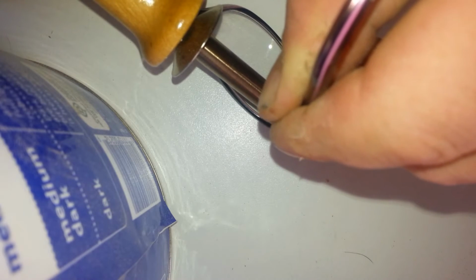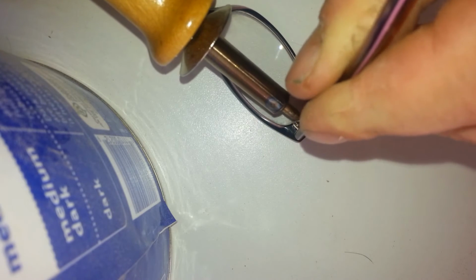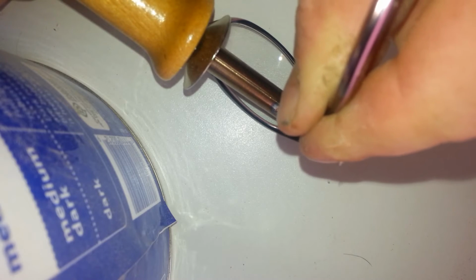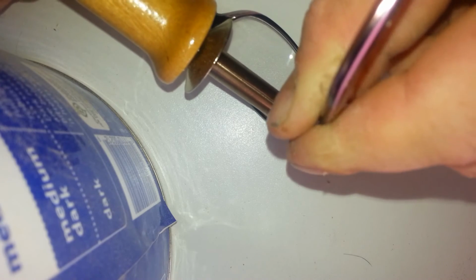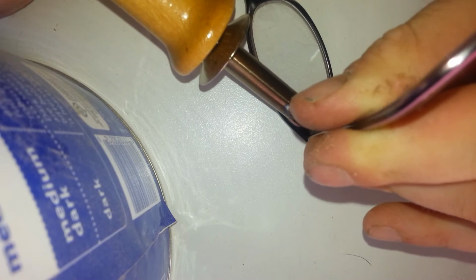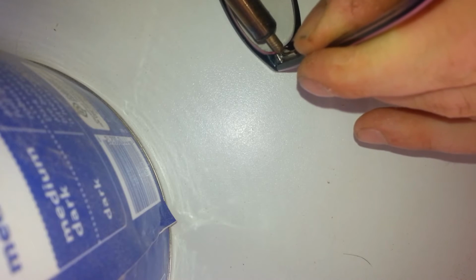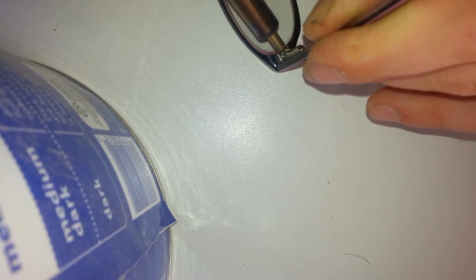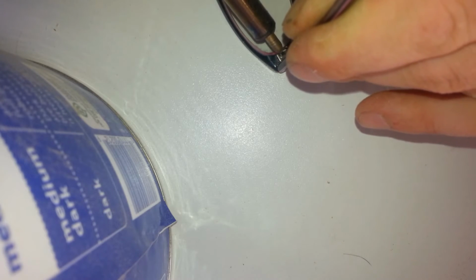and that'll allow the metal to melt the plastic that it's touching and allow the metal to slip back into the joint. I'm heating it up, and that kind of lets it slip nice and tight back into the joint.